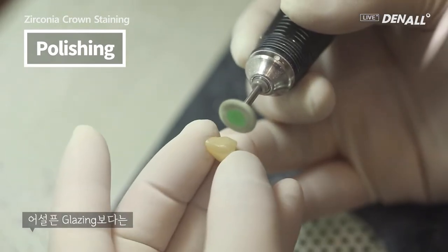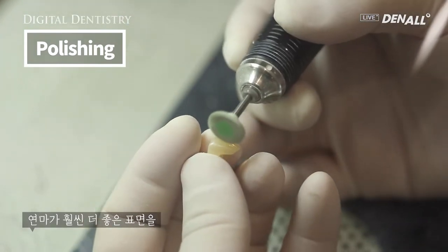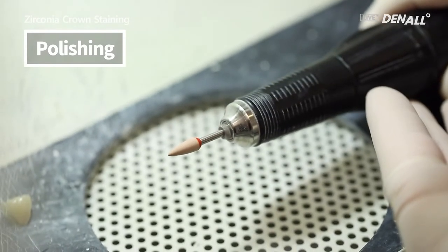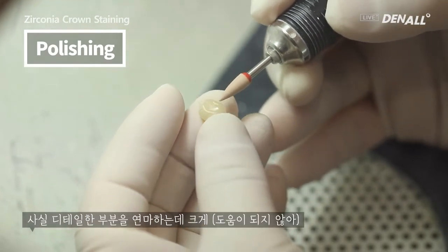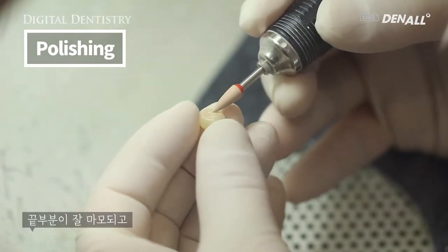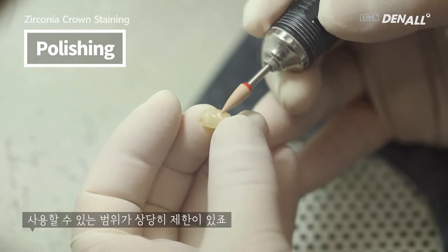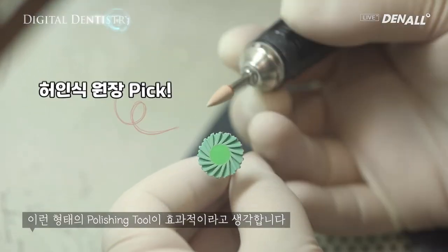Rather than unsophisticated glazing, polishing can provide a much better surface. This type of polishing tool doesn't really help for detailed groove polishing. The end of the tool can be dulled or worn out and get rounded, so it is limited in range. Rather, the polishing tool used before can be much more effective.